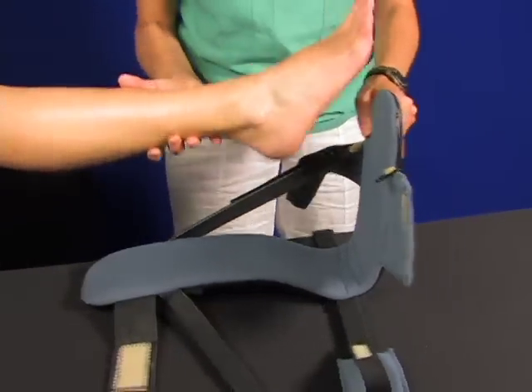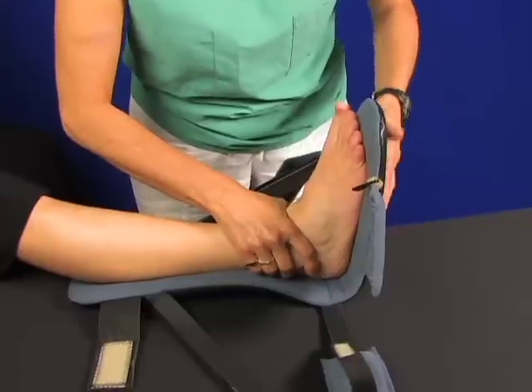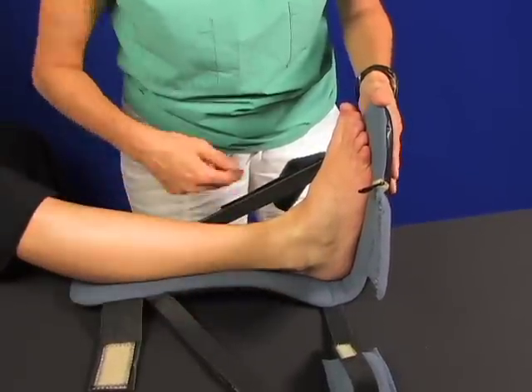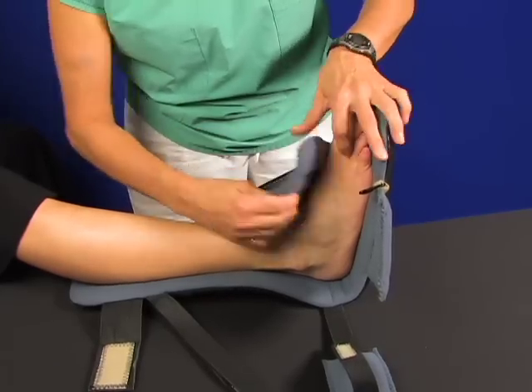Place the foot into the boot. It's already been shaped and sized appropriately, which we will address later in the video. Note the curve there behind the Achilles tendon and the curved heel area used to float the heel if desired.